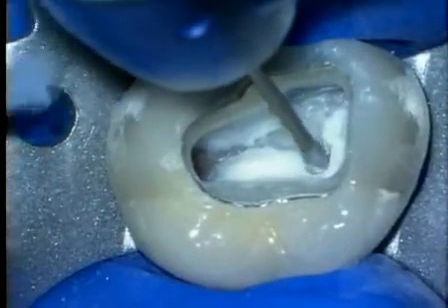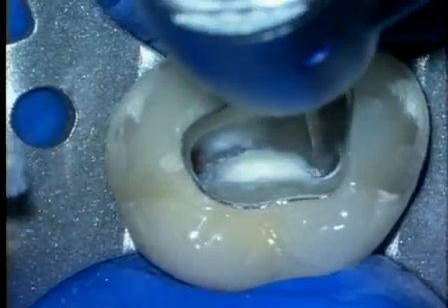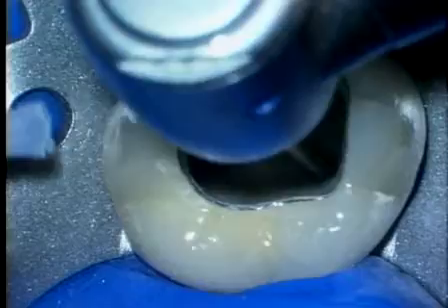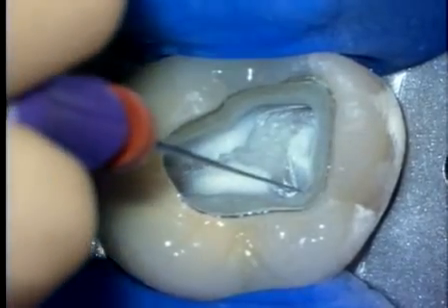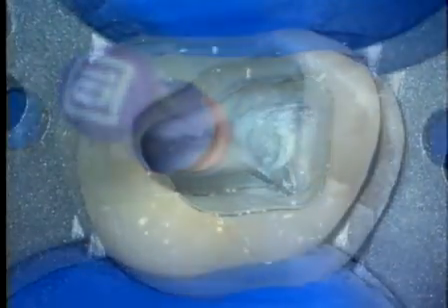Gates Gliddens can be used in an orbital arc to face off and flare the orifice. We use the belly of the GG to further refine and blend the coronal aspect of the canal into the axial walls. This allows the instruments now to pass easily down the wall, slide into the orifice to initiate cleaning and shaping procedures.